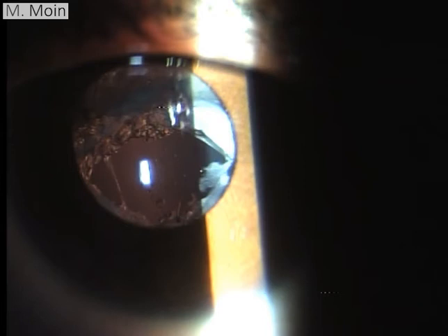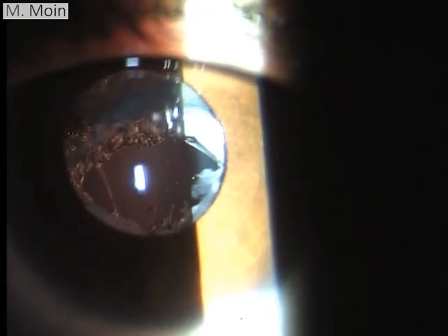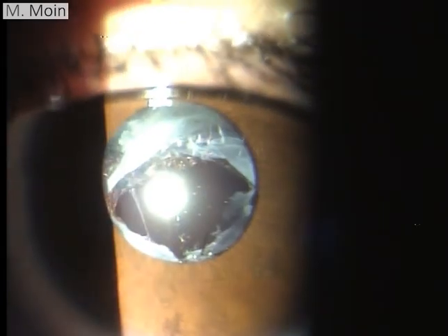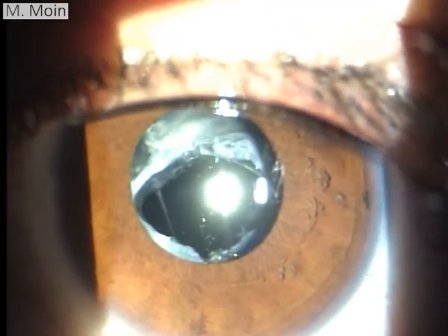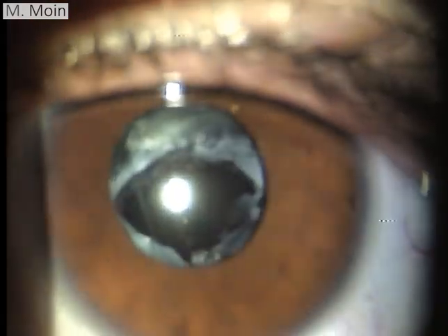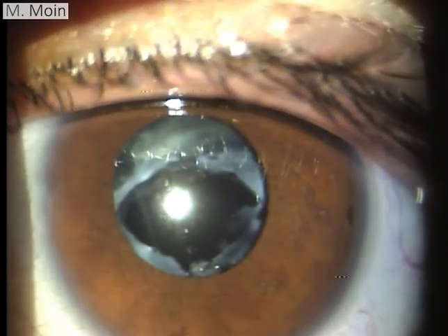And then using a cutter to make a larger hole in this area. But whenever you're doing a posterior capsulotomy you have to be careful that you do not destabilize the lens and the lens does not fall down into the vitreous cavity. That is of utmost importance. Whenever you're doing that, before you start just check if there's any posterior capsule rent which can be visualized through this.